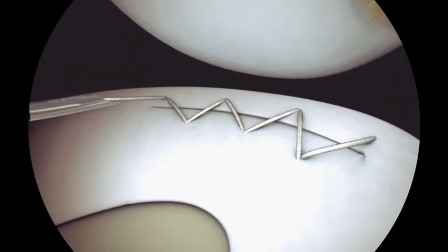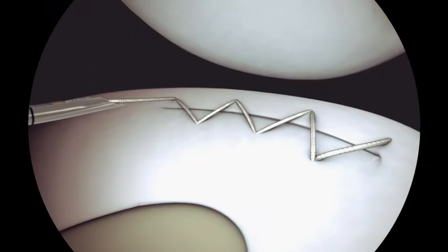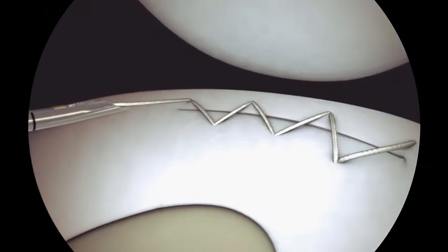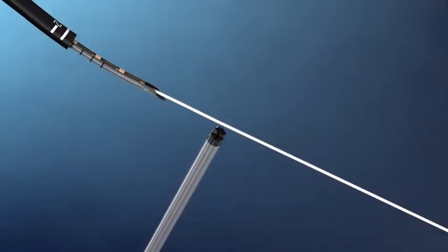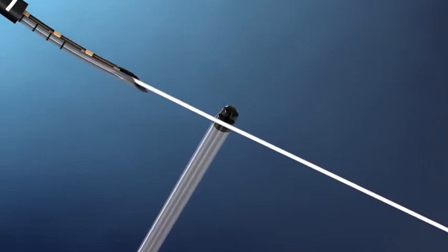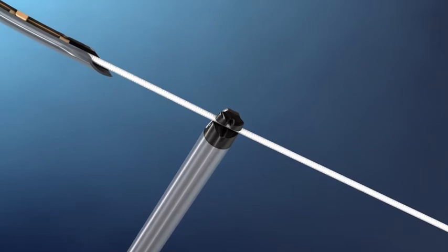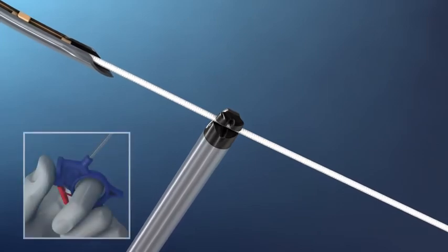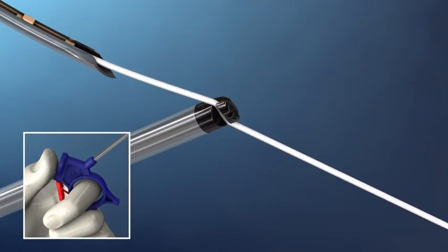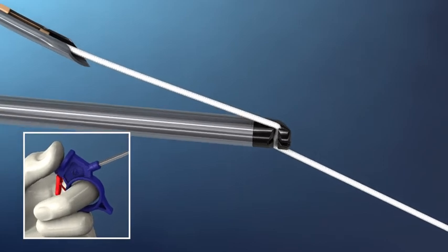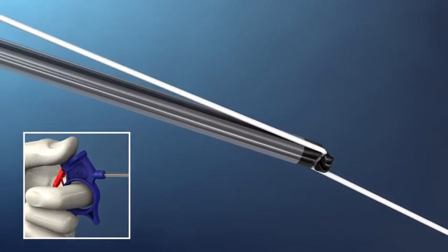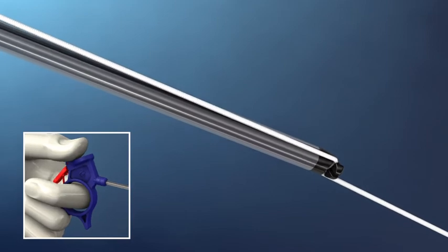After the last stitch, remove the sequent meniscal repair device from the joint. Load the suture cutter onto the suture outside of the joint. Holding the cutter perpendicular and the suture taut, load the suture into the cutter slot. Rotate the cutter shaft to align axially with the suture.